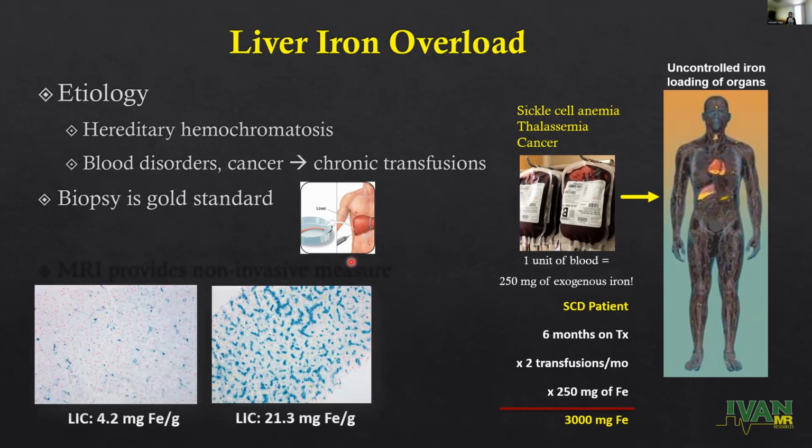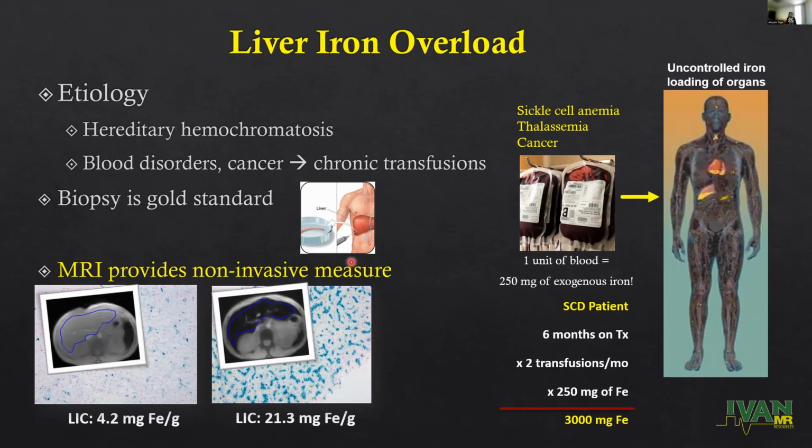But biopsy, as you know, is invasive and risky, and the patients can have risks such as bleeding and infection and other complications. Over the last 2 decades, MRI has emerged as a non-invasive measure to quantify how much iron is there.